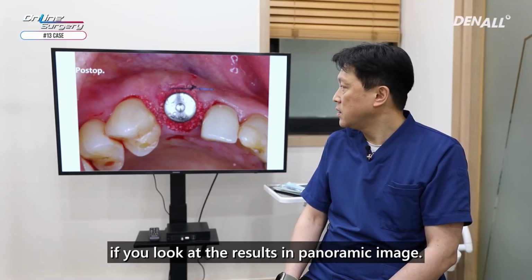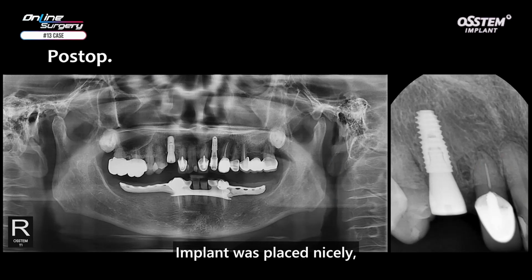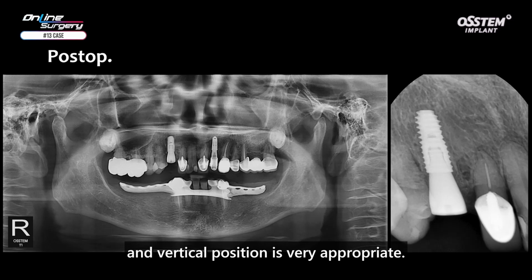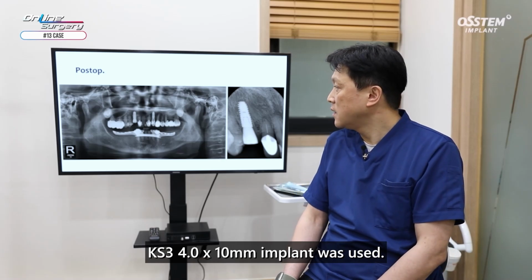If you look at the results in panoramic image, implant was placed nicely and vertical position is very appropriate. When you look at standard image, the implant position looks appropriate. KS3 4.0 by 10 mm implant was used.